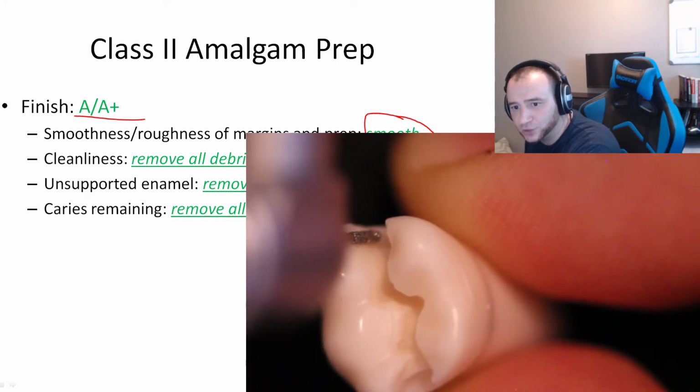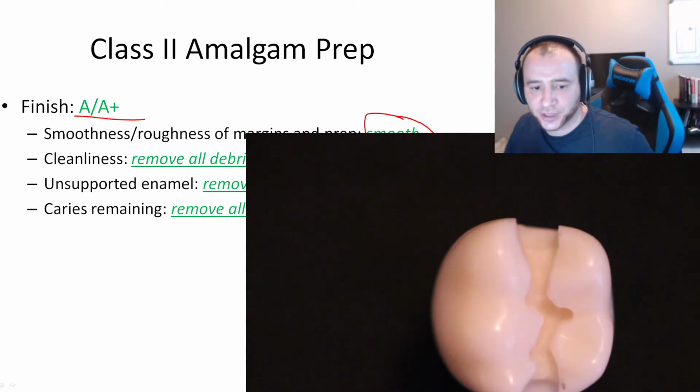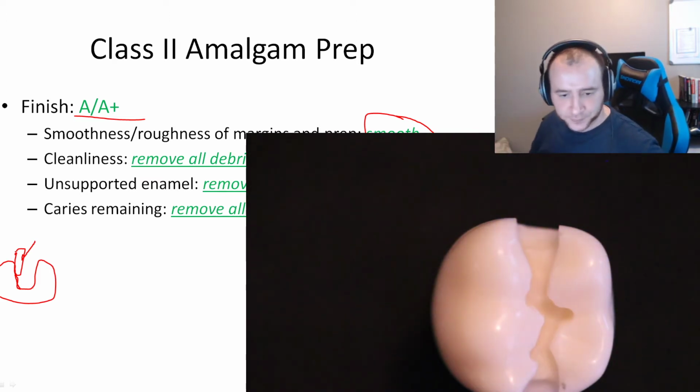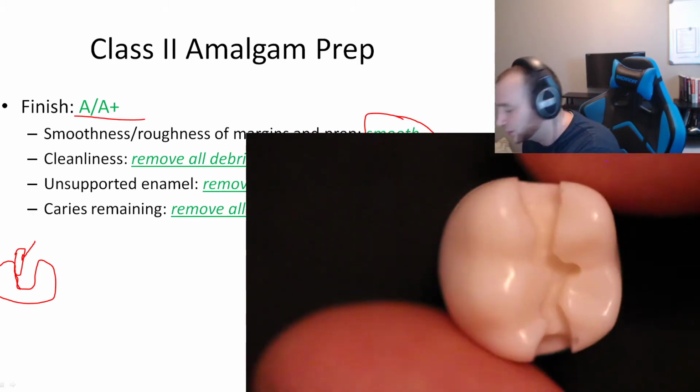Now, be careful not to do this. Don't try just to remove it here like that. If you do this, you're going to have a weird looking wall. You're going to have a wall that may look like this proximally. So you might have this shape, let's say. You see? So you don't want this. If you put your burr only halfway to remove the unsupported enamel, you might get this kind of shape, right? You don't want that. So that's why I'm saying keep your burr along the entire wall, okay? To maintain the convergence, the straightness and the smoothness of the wall, and just remove the unsupported enamel. And put a fender wedge so that you don't hit the adjacent tooth, right? So that's a really good technique as well.